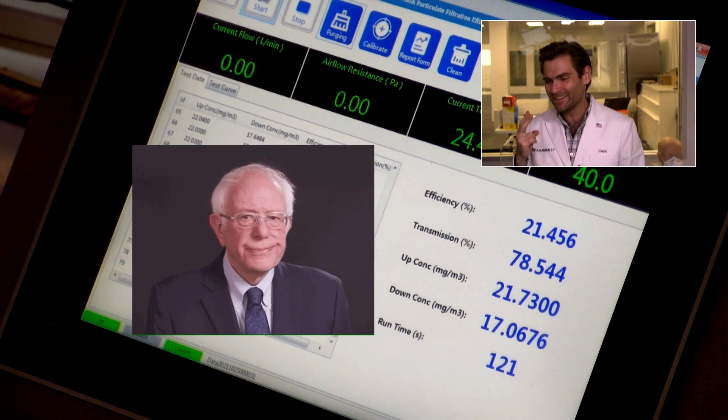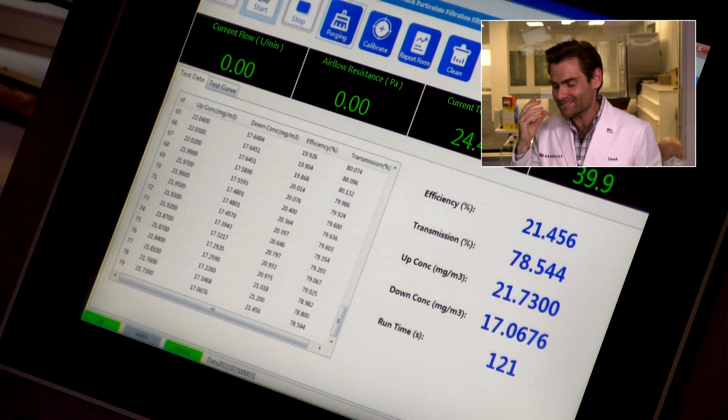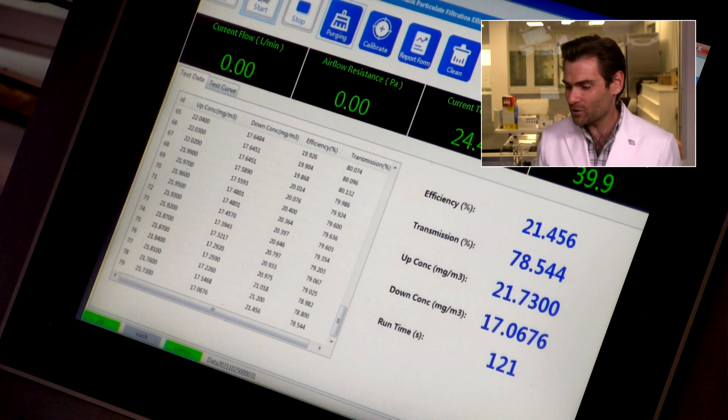This is two for two — it makes me feel good to find them. The reading is 21.456%. I mean, that's just terrible.